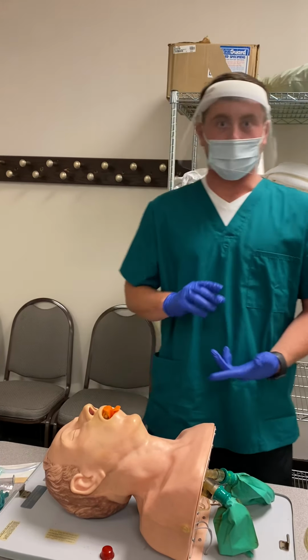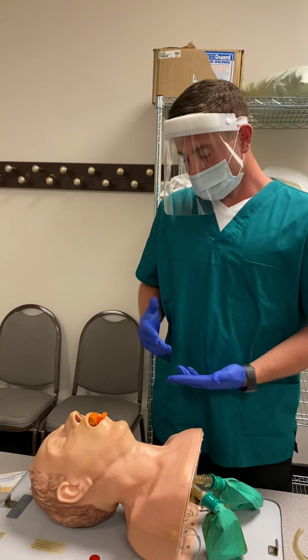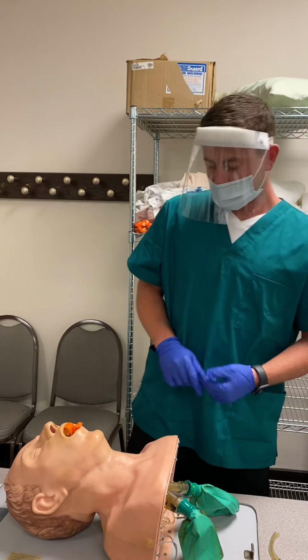After doing so, I will perform more vital signs and reassess, and then I will document everything into the patient's chart.